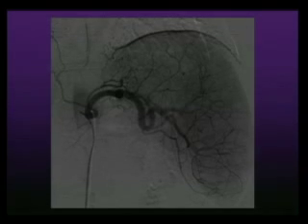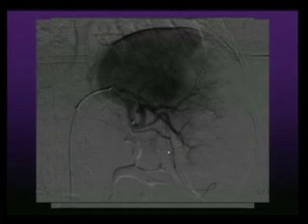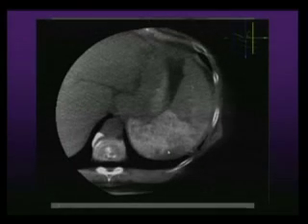So you see the massively enlarged spleen. You need to take a good anatomy, see where all the arteries are coming from, see what is feeding there. So we went super selectively into the spleen and embolized the lower pole, and another branch of the lower pole. This is the post. We embolized about 40-50% of the lower to mid-polar region, the interpolar region, and spared the upper pole. This is the same cone beam CT for that patient.